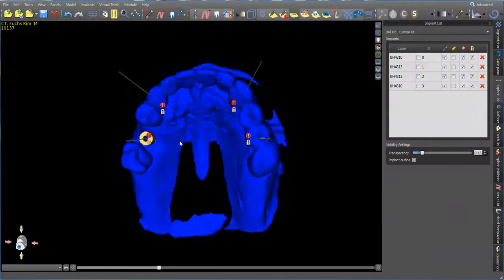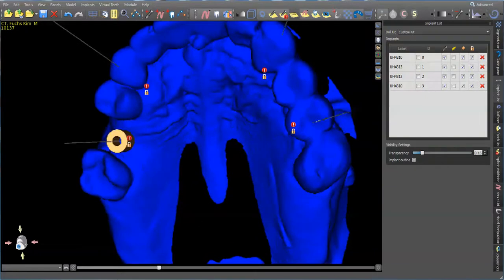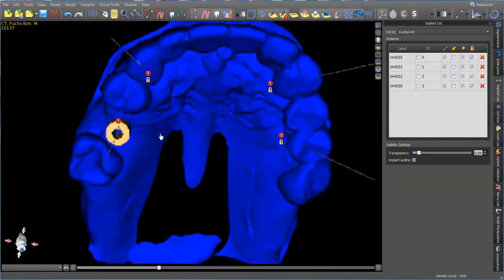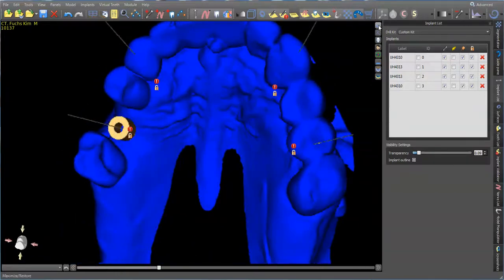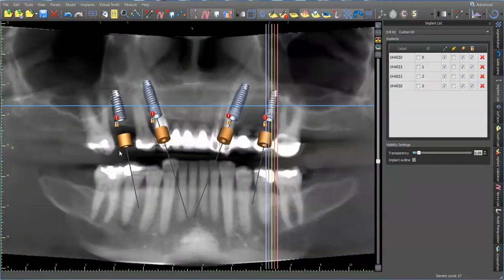The neat part about this is, I want to make sure that all these are coming out of the teeth. You can see in the canines it's coming out towards the lingual, from the central fossa groove here. So what I'm going to do is, in this image you can see it better, I want to get a hard tissue guide, so I'm going to use this tooth and this tooth for support.